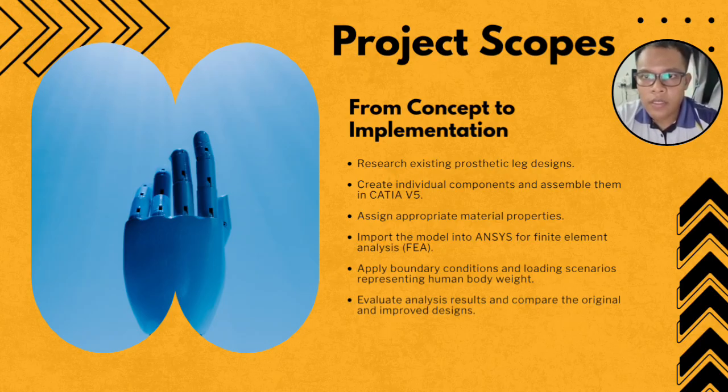Evaluate the analysis results and compare the designs. The simulation results were evaluated by analyzing the equivalent stress, total deformation, and safety factor (FOS). The original design was then compared with the improved design to determine which design provides the best structural performance while maintaining safety. This approach has produced a design that is safer, stronger, and more reliable while reducing development time and costs.